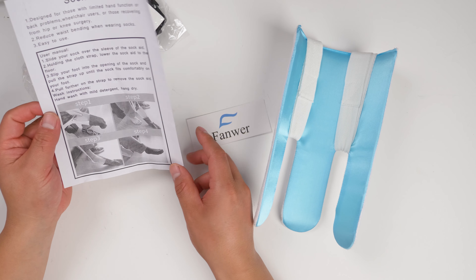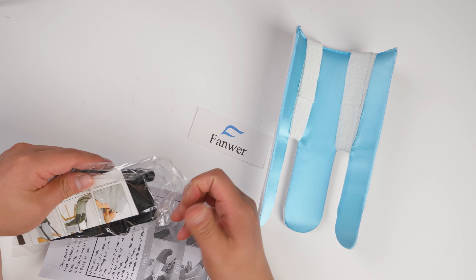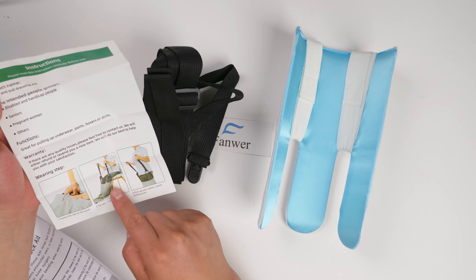And here comes the how-to-use-it manual. You can pull the trousers on.